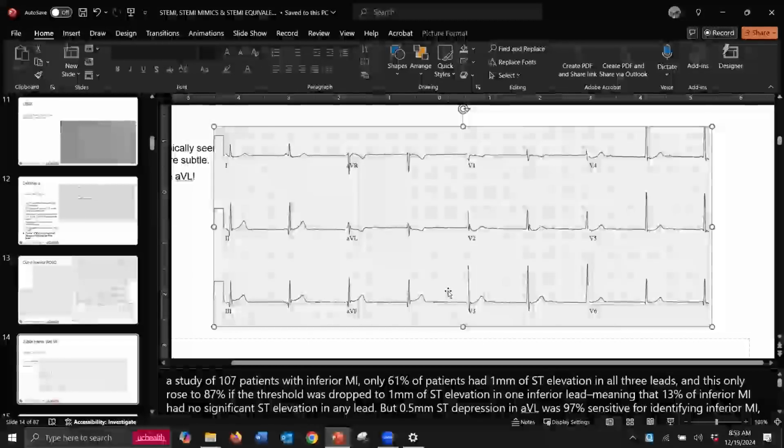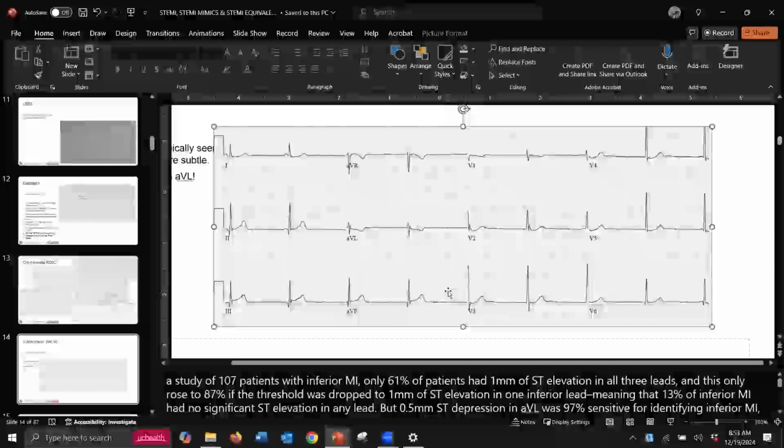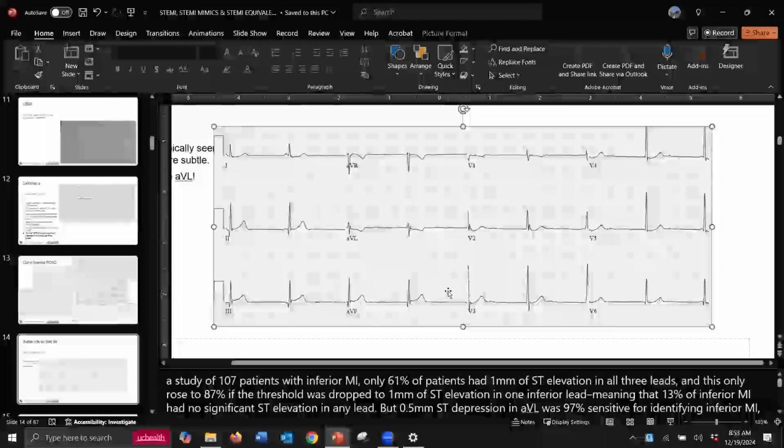Okay. Not enough to call on the radio and say, hey, we're coming in with a cardiac alert. Fire up the cath lab if you have one. That's still split. But wait for it, because it's going to happen. And then you've got a 15-minute transport. It's probably going to happen that quickly. Now, we may see some changes with our treatment, right? We give aspirin. We don't see a change with aspirin.